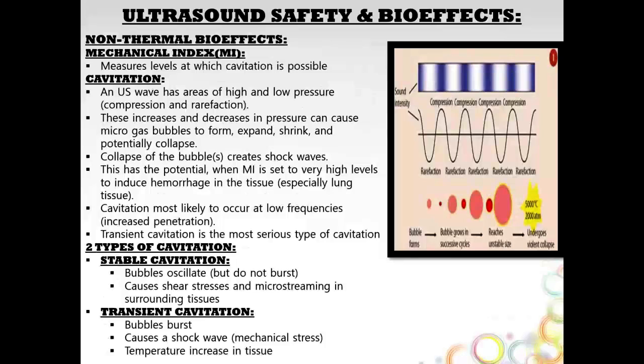Non-thermal bioeffects. So this is our mechanical index. This measures what levels at which cavitation is possible. And what cavitation is, basically, ultrasound waves have areas of high and low pressure. This is our compression and our rarefaction.